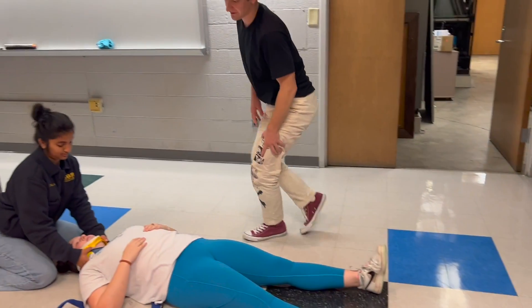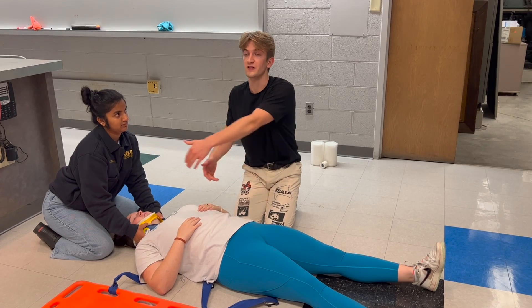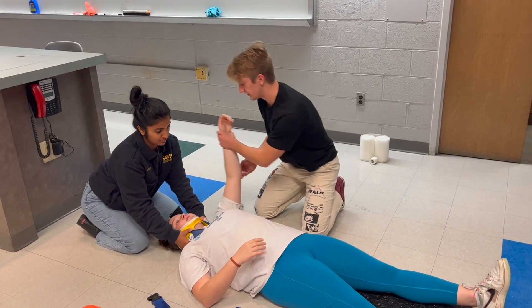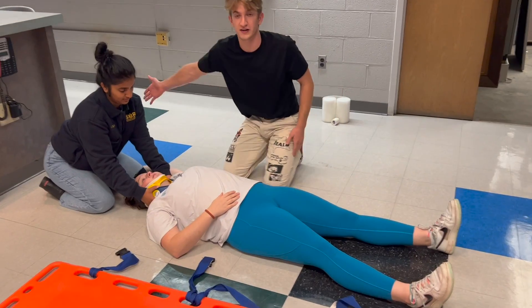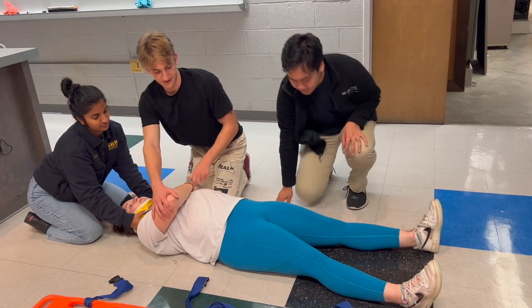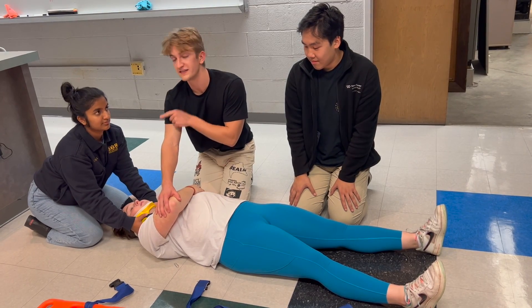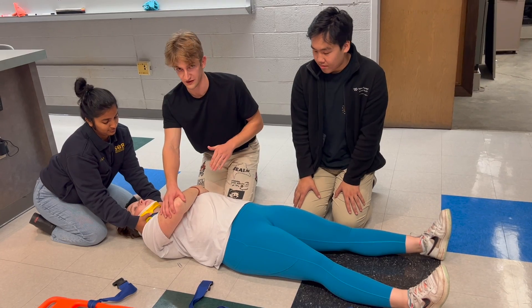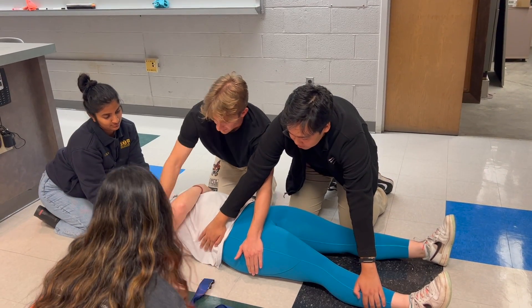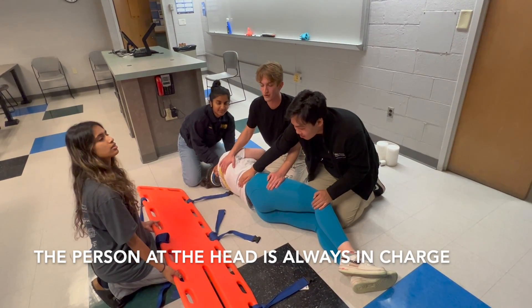After we've done PMS, we are going to complete our rapid trauma assessment by feeling down the back during our log roll. To properly log roll, you will put the patient's arm that's closest to you straight up and down to form a line across their body on which they will be resting as they're rolled, and then put their other arm across their body. You'll have a partner help you — it's a very slow and controlled process, with the person at the head taking control so there's no exacerbation to the spine. My partner and I will cross arms as we take hold of the patient and I will grab here for support under their arm.